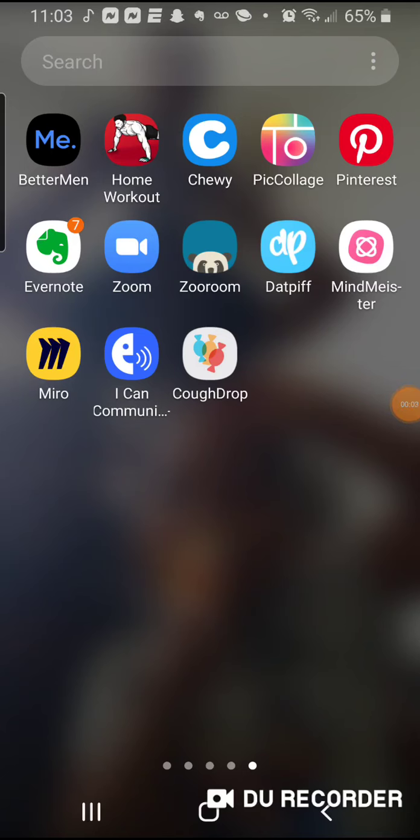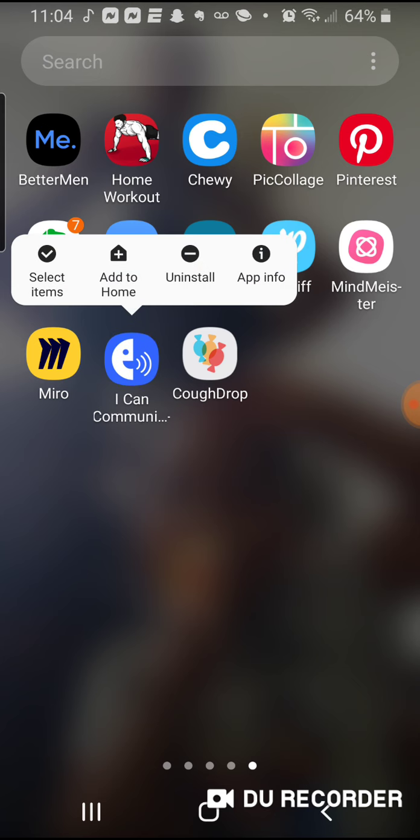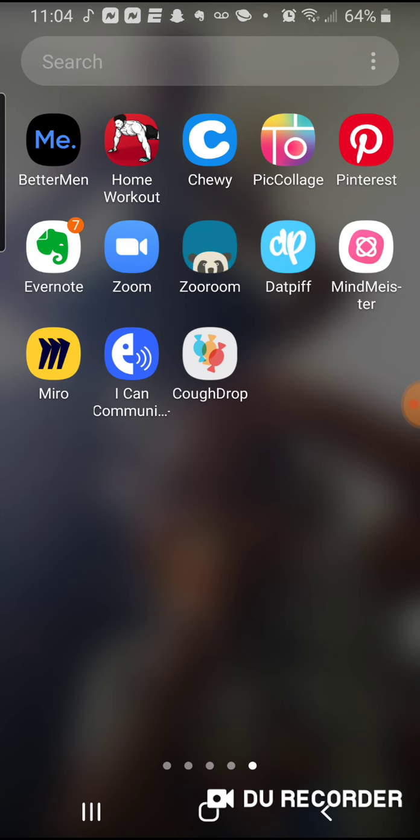Today I will be using an app called I Can Communicate to turn any smartphone into a communication device for nonverbal individuals. And this app can be downloaded to any phone straight from a Google Play Store or an Apple store that you may have on your phone.